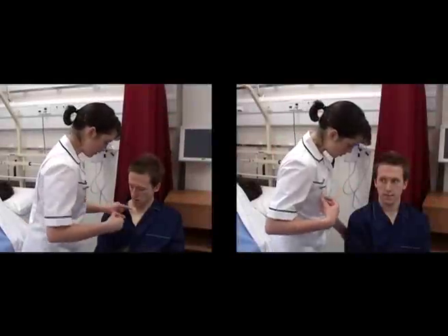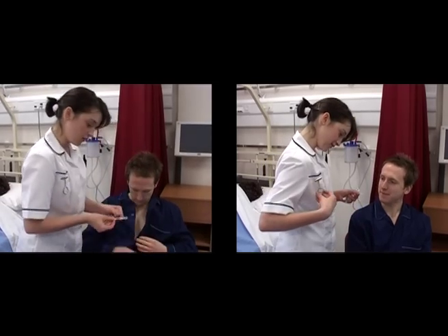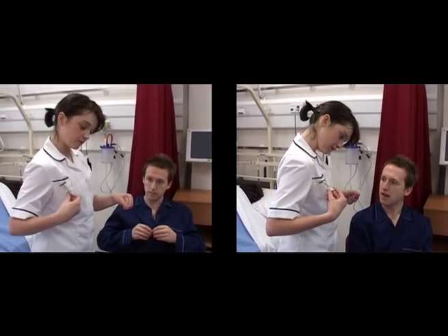Remove the thermometer from the temperature measurement site after the appropriate length of time, taking care not to touch the dot matrix.